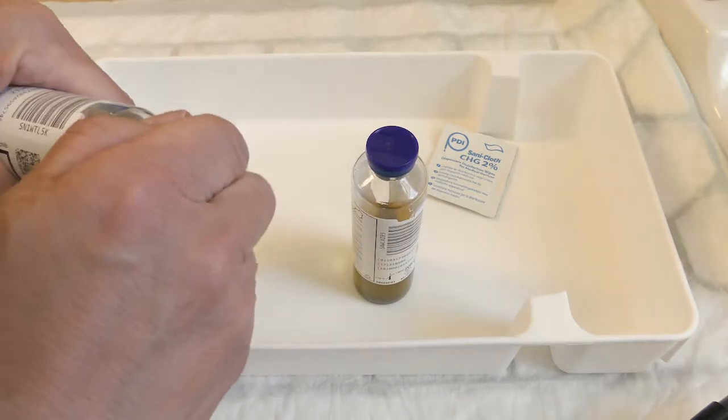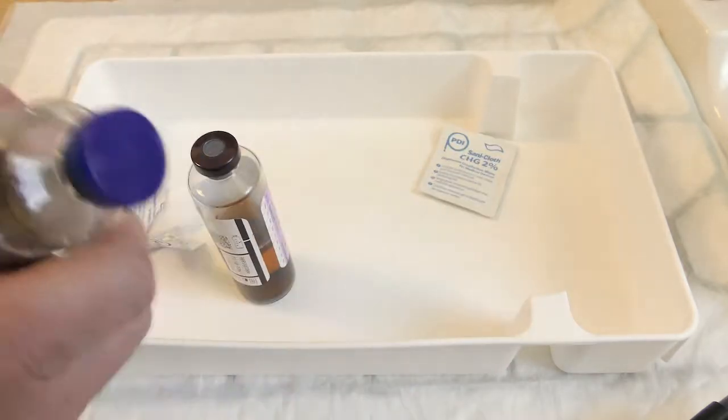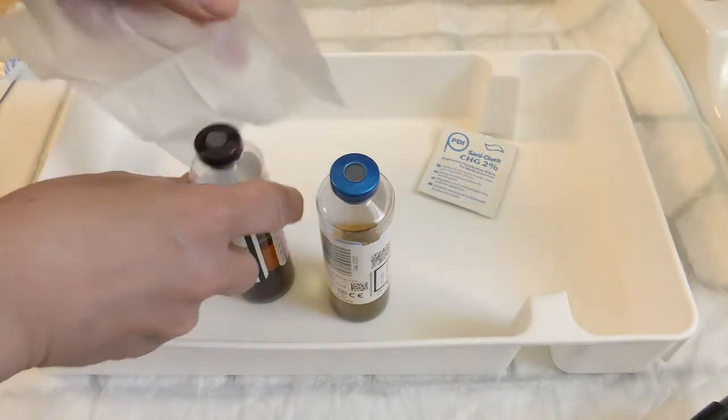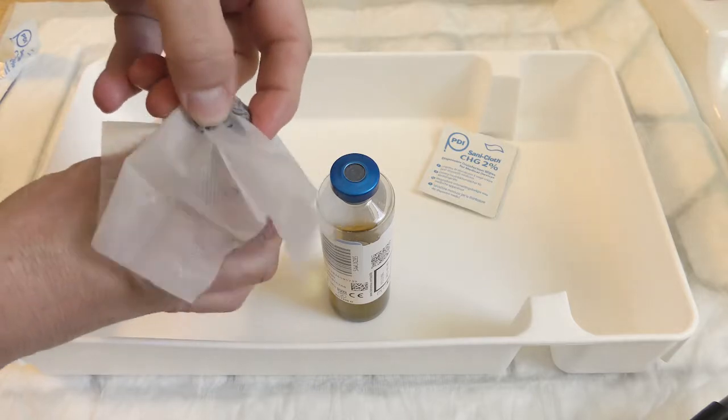Remove the dust caps. Thoroughly clean the top of the bottles.